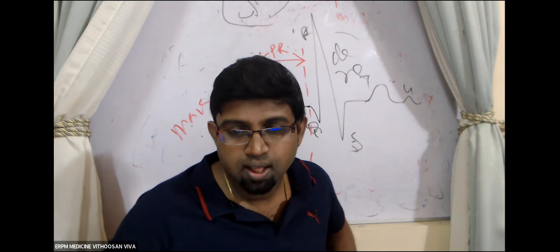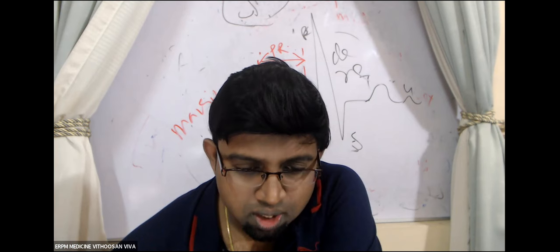It's very important to know that, because in a proper ECG class, in the viva class, we'll study that if the PR interval is prolonged, we call that a first degree heart block. So what is determining the PR interval? The inherent delay of the AV node.